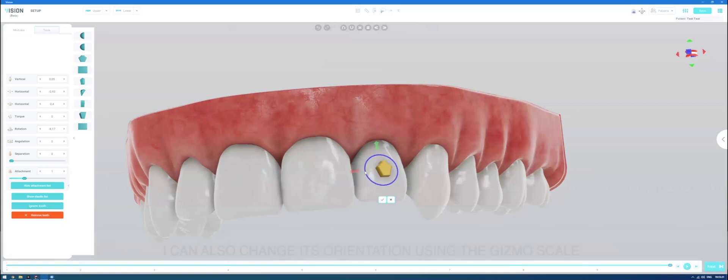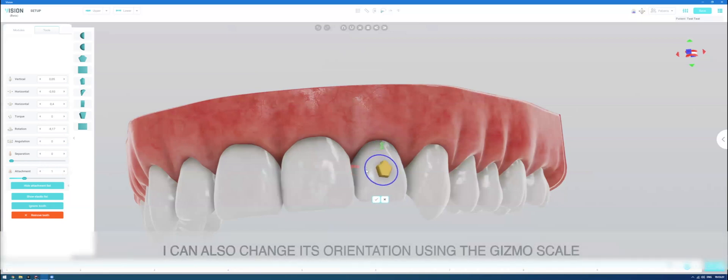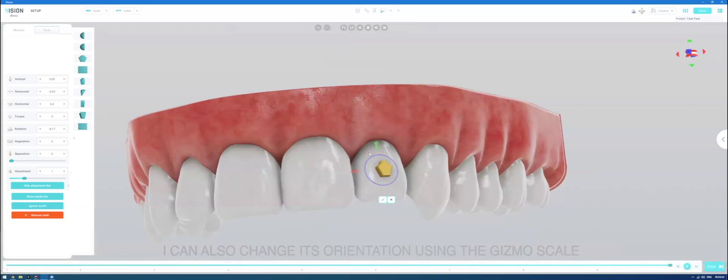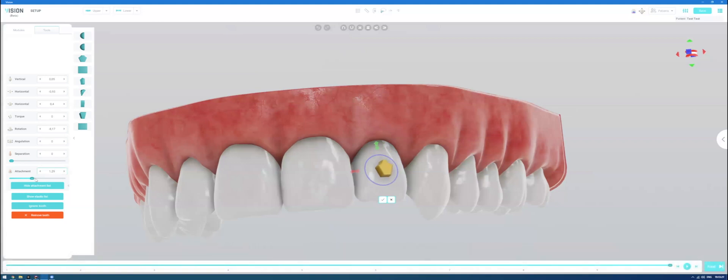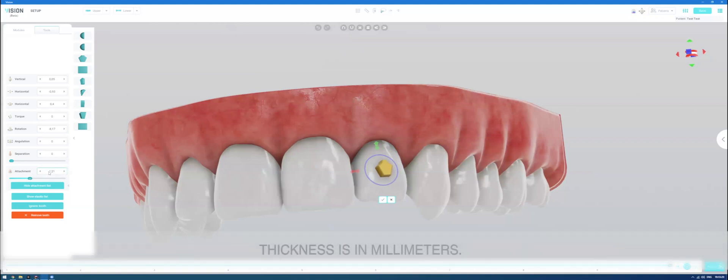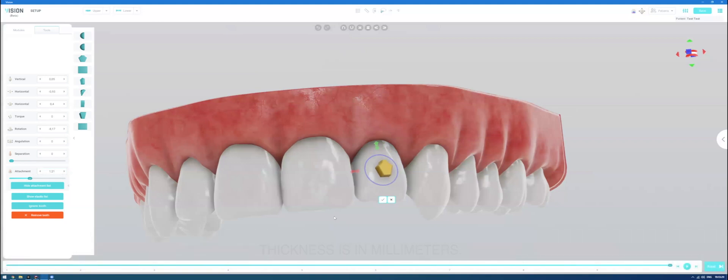I can also change its orientation using the gizmo, scale, and change the thickness on the left. Thickness is in millimeters.